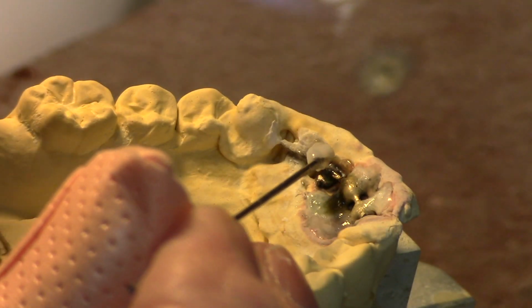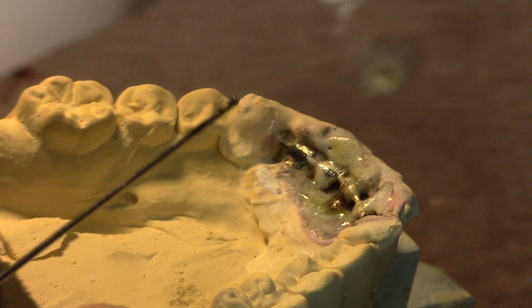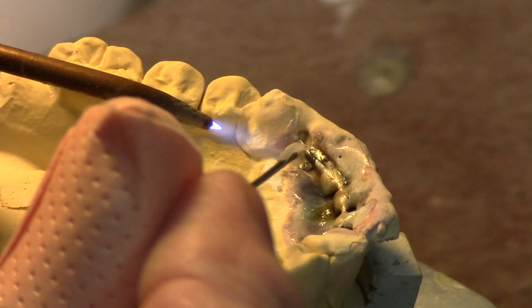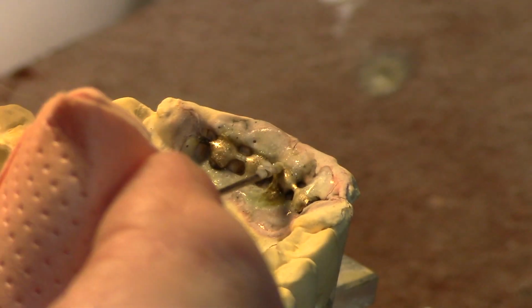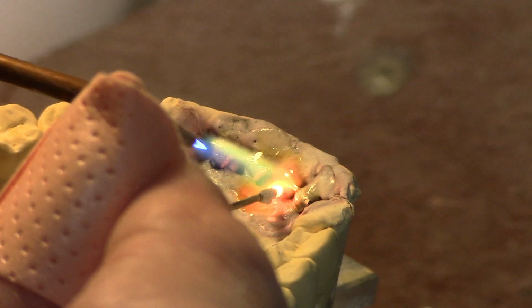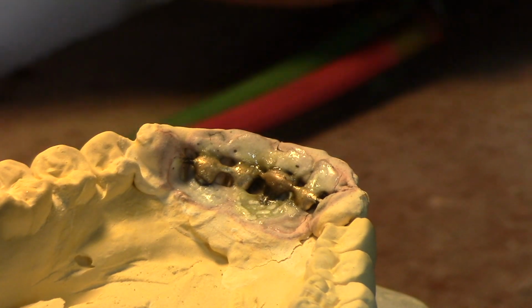Nice thing with it being anchored down like this is I can go ahead and soak it to dissolve the flux so I can see what I've got. There we go. Yeah, I don't think this one got onto the pad. I think it just got wrapped around the wire. So go back in there and heat that up again, see if I can get it onto the pad. A little more flux here. Okay, I may have messed that one up. I don't know. I'll have to just put that in the water and let the flux dissolve and see where I am on that. So we'll do that and take a look at it.